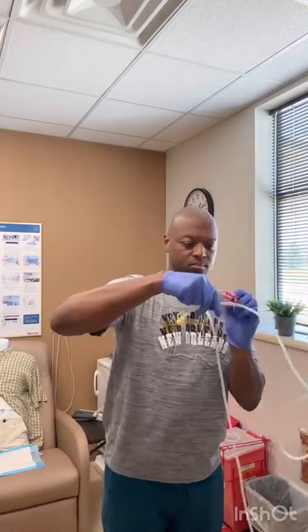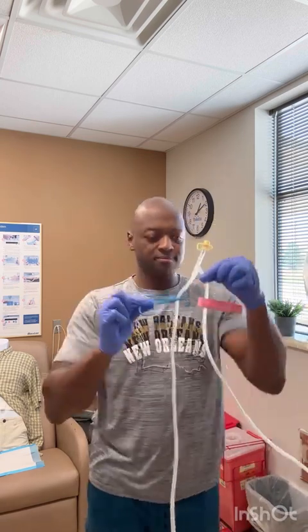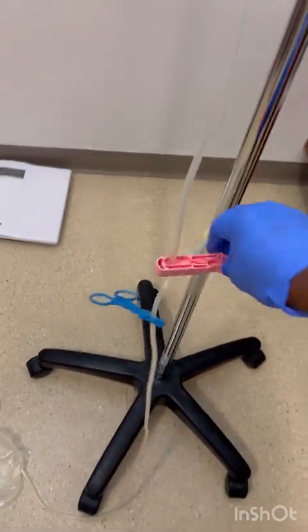I'm going to take my red clamp and put it on the fill line — that's called the fill line because that bag fills inside of you. Blue clamp on the drain line — that's the drain line because it goes to the drain bag. Drain bag shiny side up and I'm finished with that.